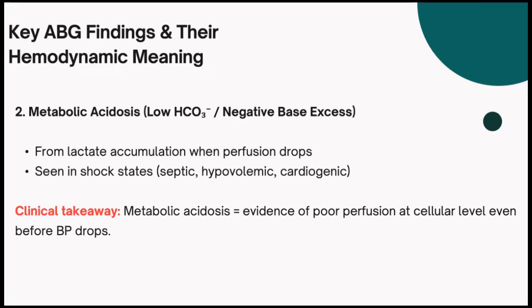So your timing, we cannot say, okay, you have to do 2 hours or you have to do 30 minutes. It depends on the patient. So you have to decide on the patient, and you have to discuss and see whether we are going to do it at 2 hours. You also feel that, because when you do blood gases, you know the next one should not be done that fast, or there won't be a change that soon, right? So likewise, you can think about it like that.